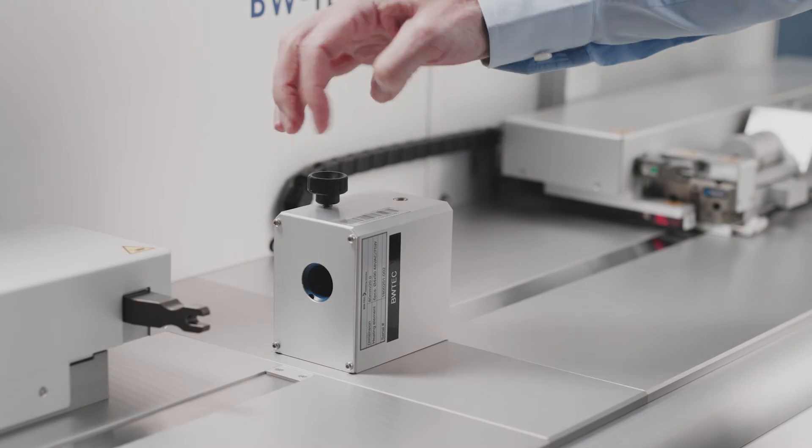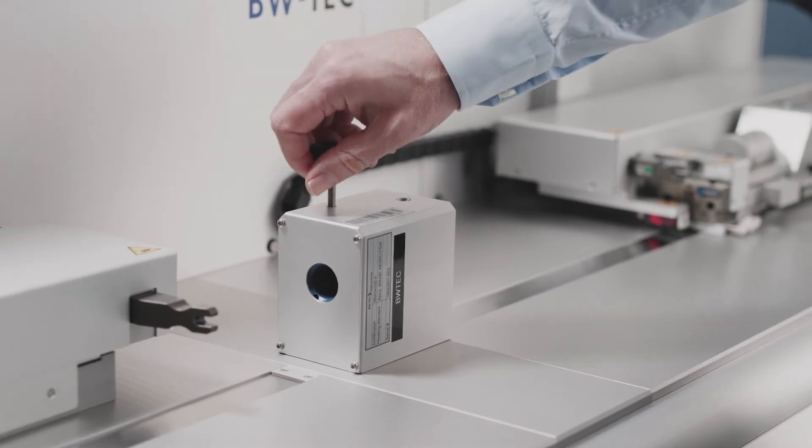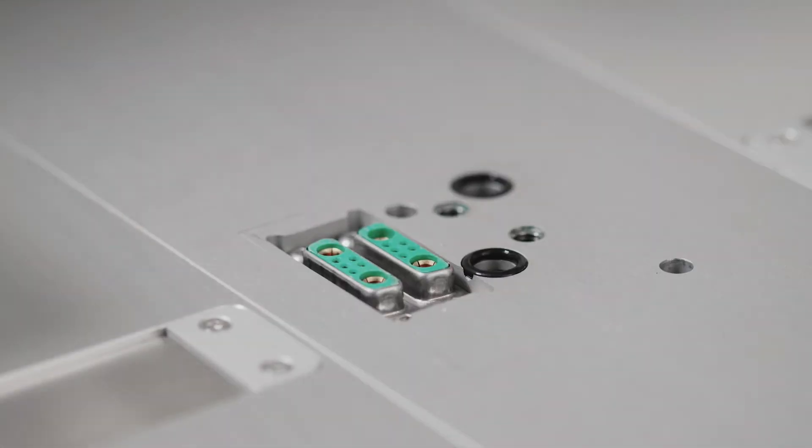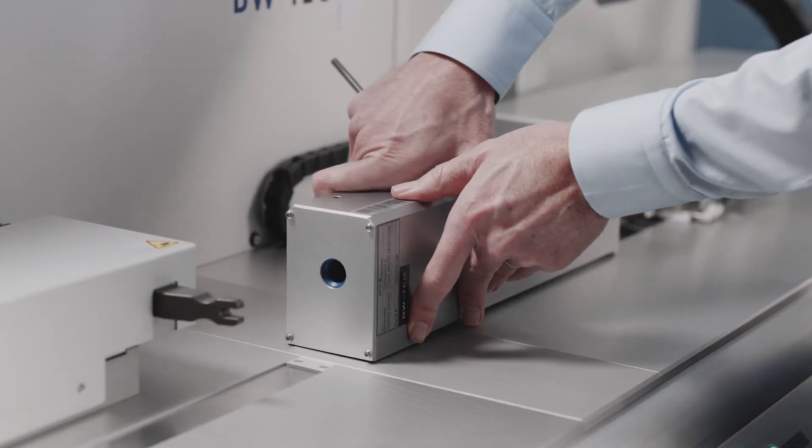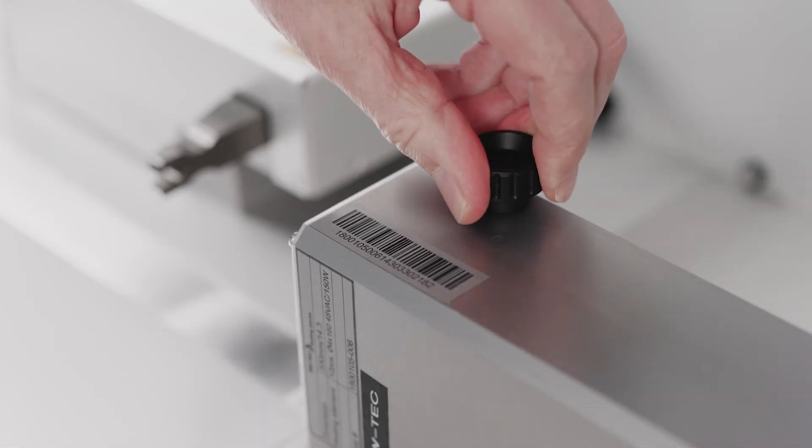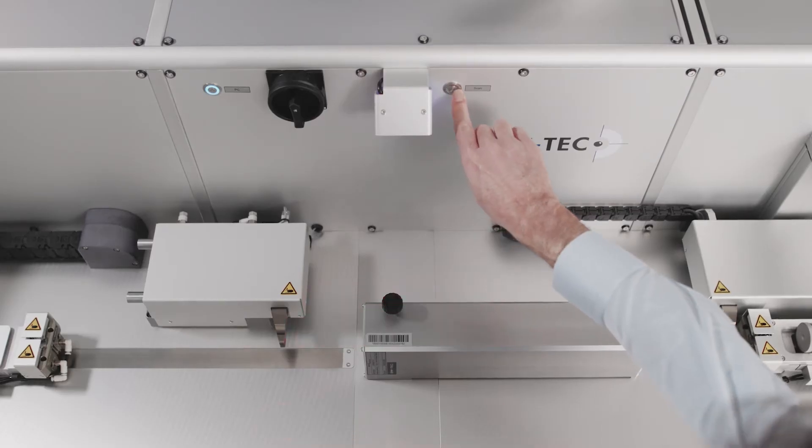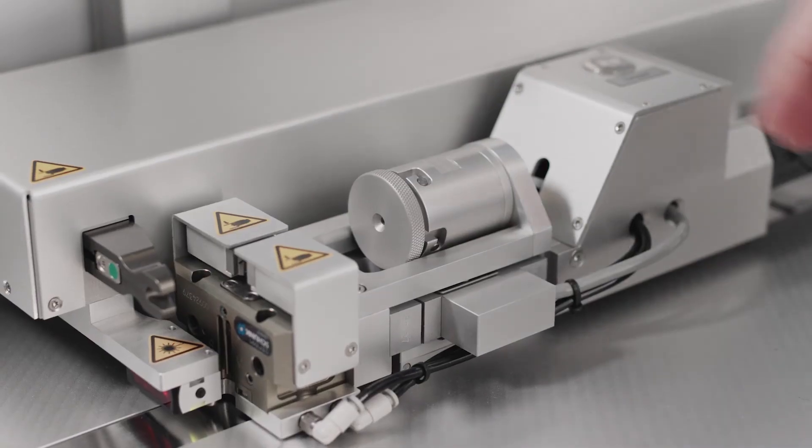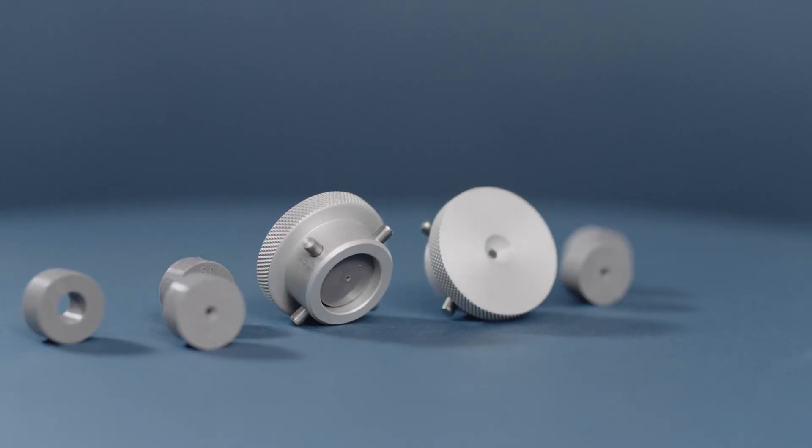There are easy changeable heating blocks with integrated water connections for different diameters and lengths. The barcode scanner compares the heating block with the recipe to prevent any mismatch. Furthermore, there is a high pressure connection with the BW tech quick release for fast exchange of the clamping ring sizes.